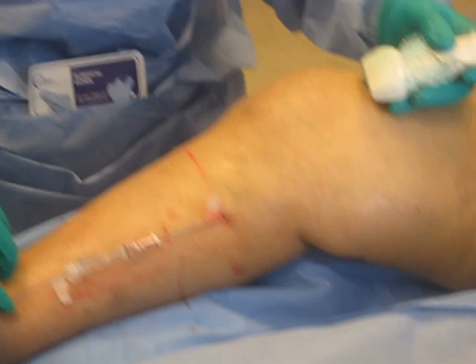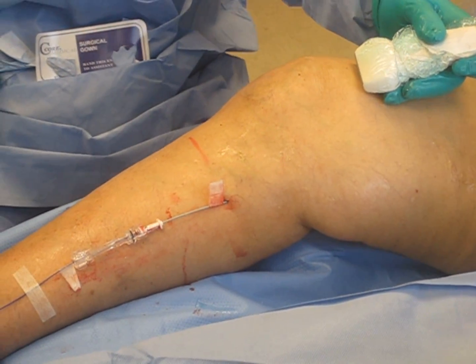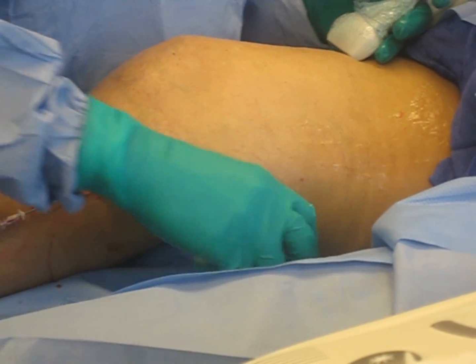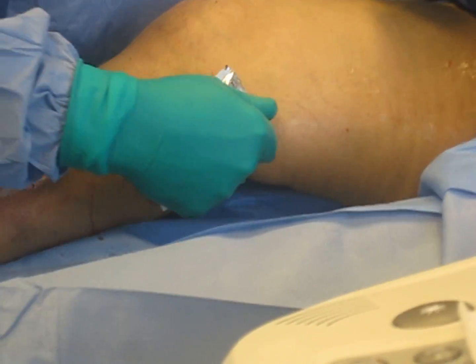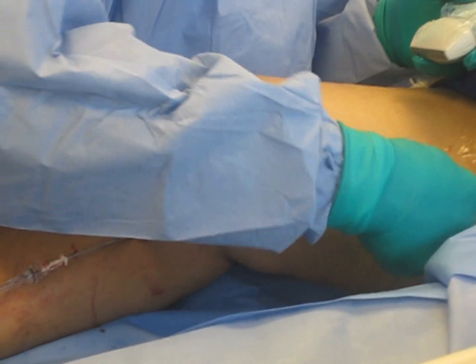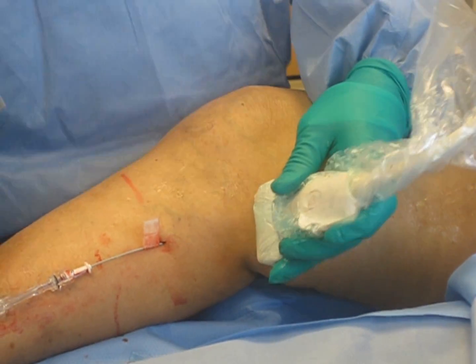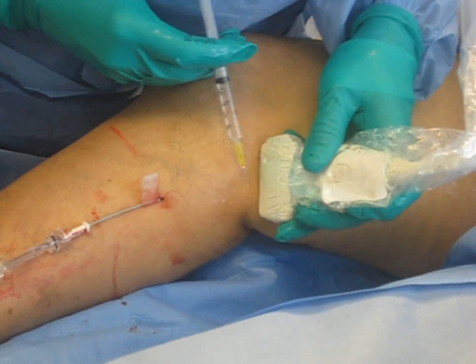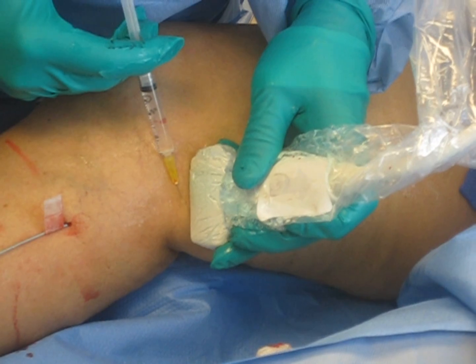Nancy's going to anchor that. Our next step, which probably takes the longest, is actually pumping the local tumescent anesthesia around the vein from top to bottom. I'm going to do some small superficial numbing here — one right about here. I'll try my little mosquito technique; she's a little sensitive today.